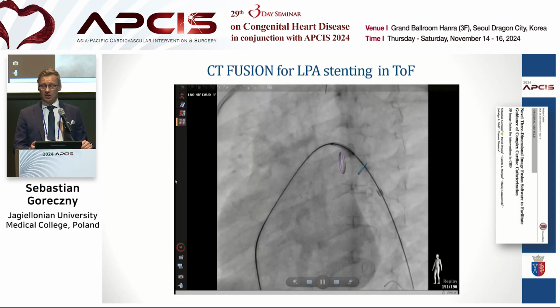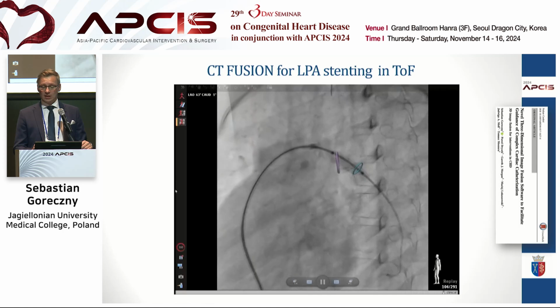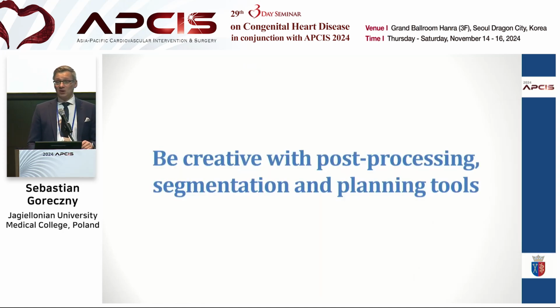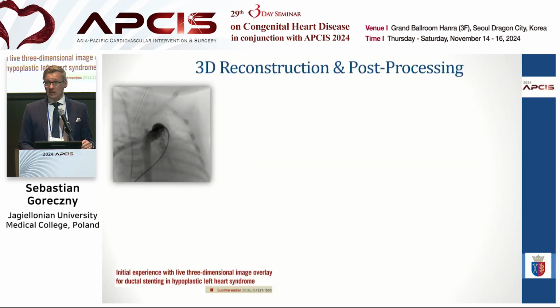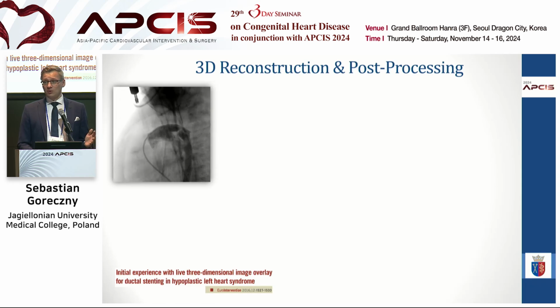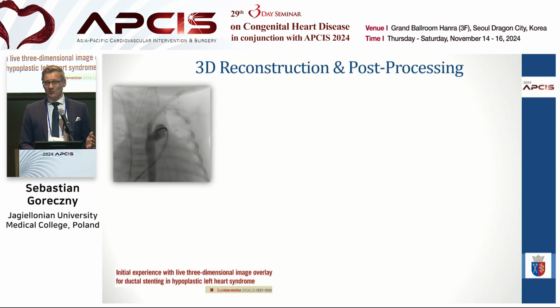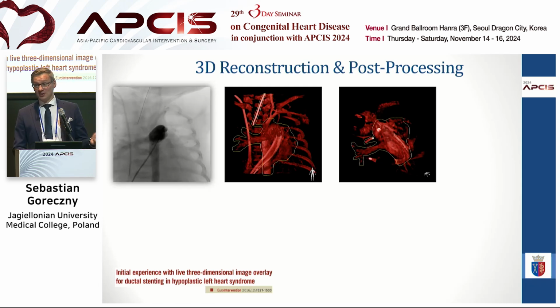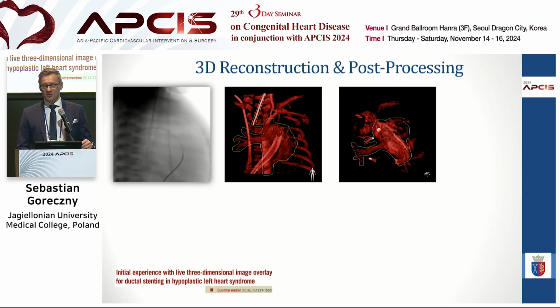You can have the entire 3D volume exposed and visualized, or you can just have rings there. I encourage you to be creative with using these software tools. Several years ago, when we started with 3D, we didn't have many tools except cut. So we could cut either outside or inside. There were no marking points, no rings.